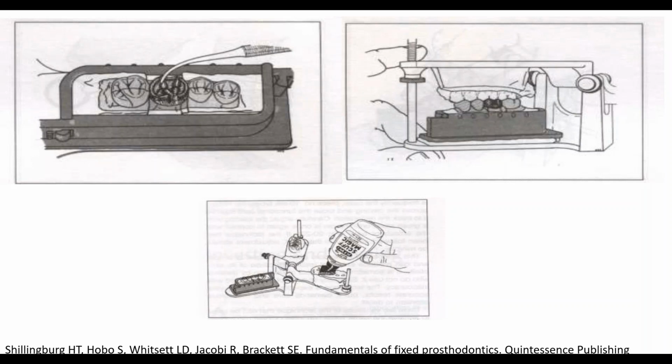High points are removed, and the tooth anatomy is maintained and can be shaped with the help of the functional core.